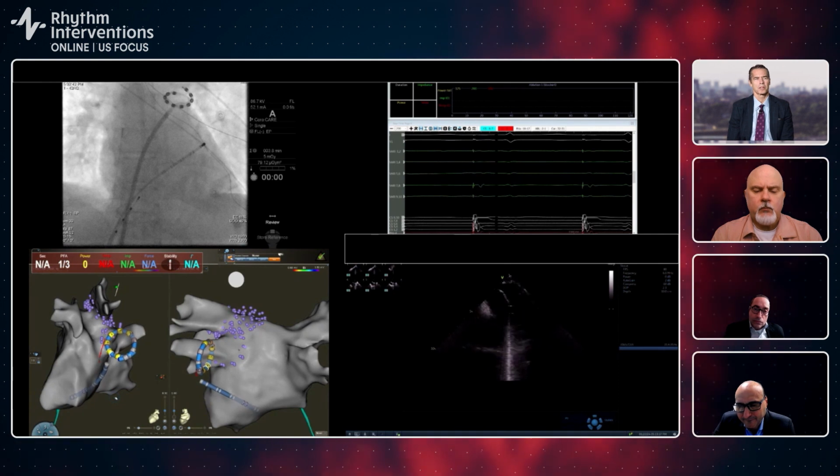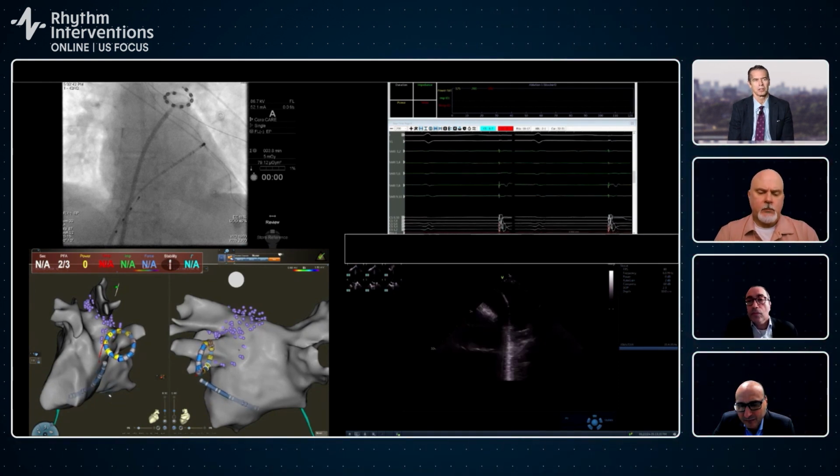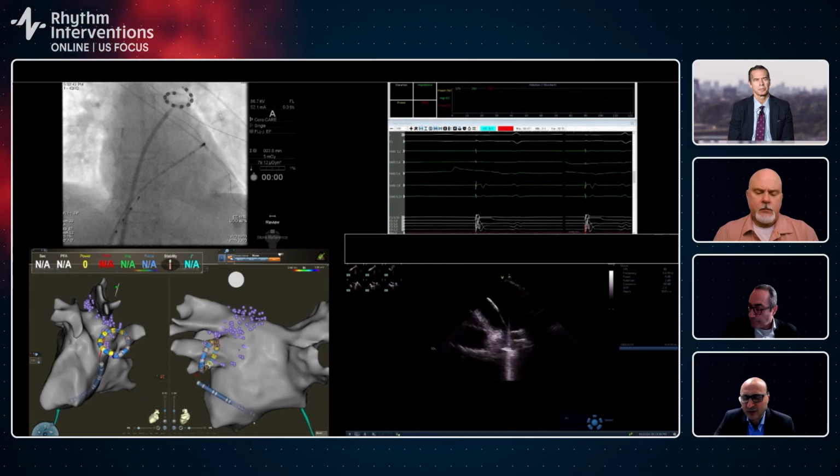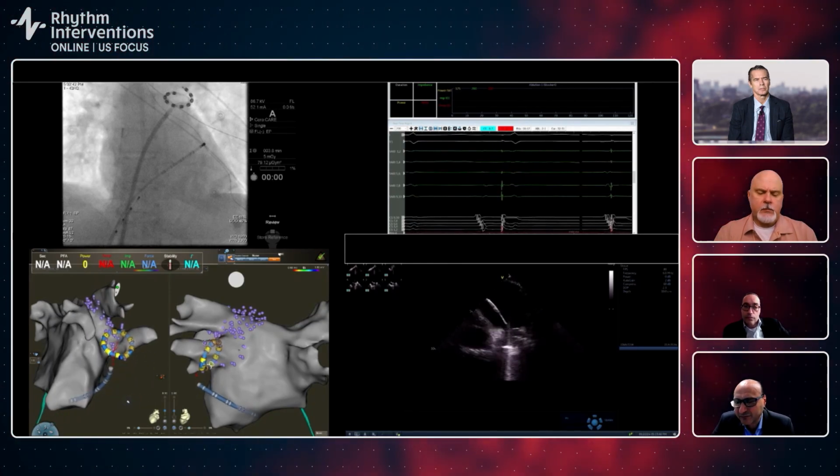Can you be more specific? Are they bipolar pairs you pick, or unipolar? You pick each individual electrode? No. So you can eliminate 4 at a time, and these 4 have to be consecutive.